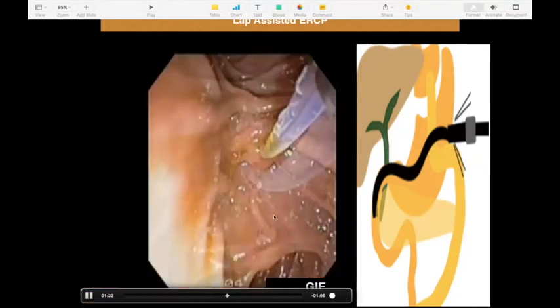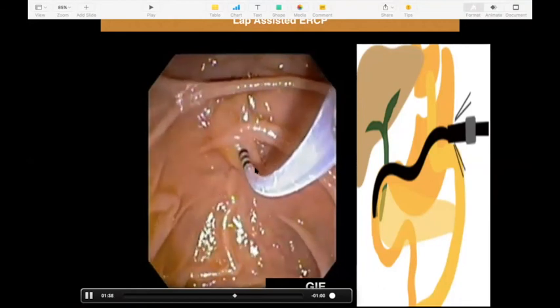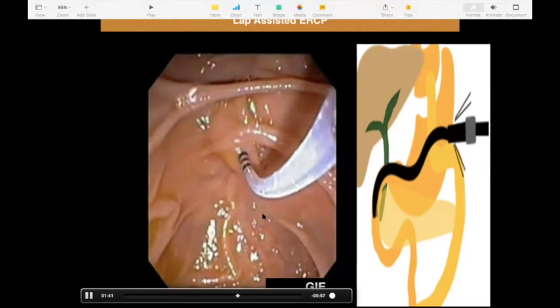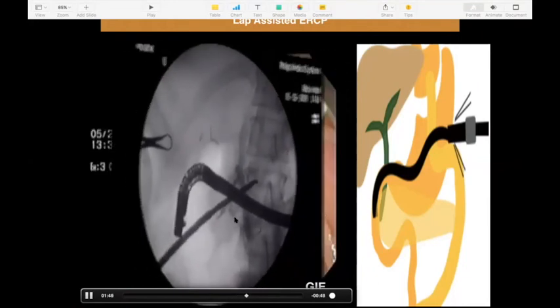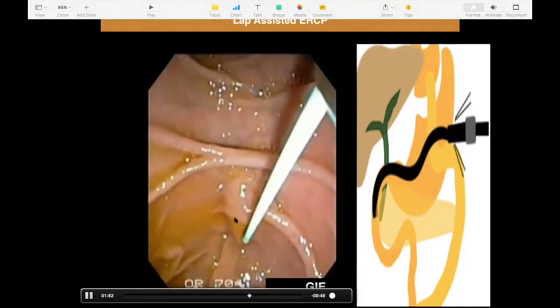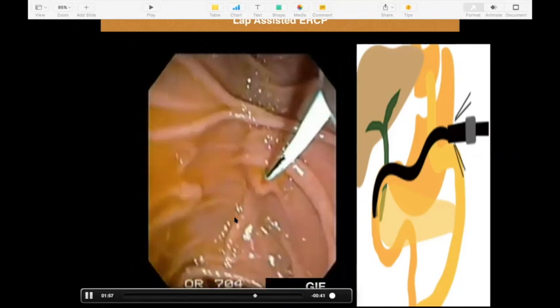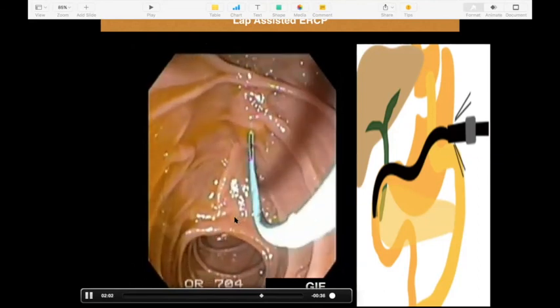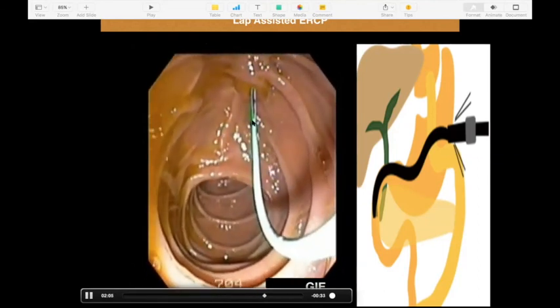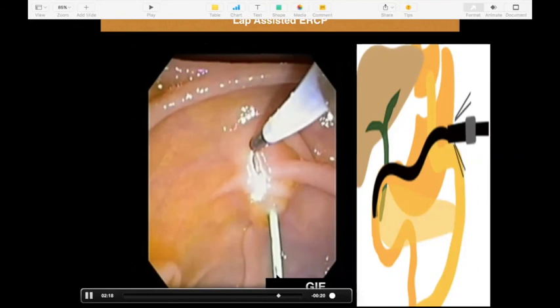You can see that this looks like a normal ERCP, but the wire has gone into the pancreatic duct. Because the anatomy is reversed, what we saw looks like a bile duct, but it's basically a pancreatic duct. So this will happen in patients who have altered anatomy. If we get a PD in the first attempt, we should always put a wire and a stent. We should not wait and attempt again, and then the biliary path becomes easy. In this case, because it went into the PD, the operator will do a pre-cut, open the bile duct, and complete the ERCP.